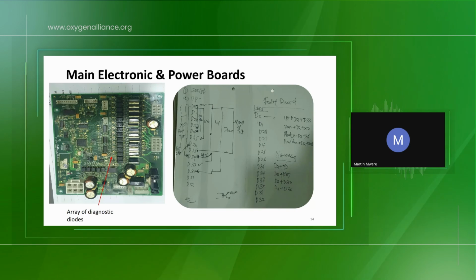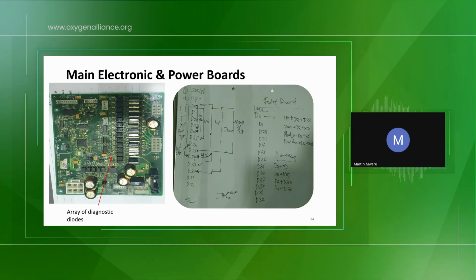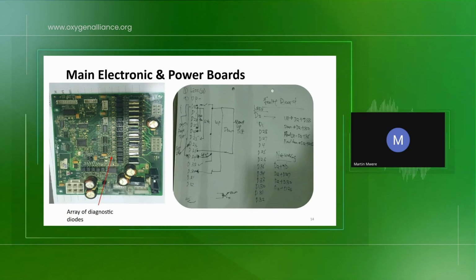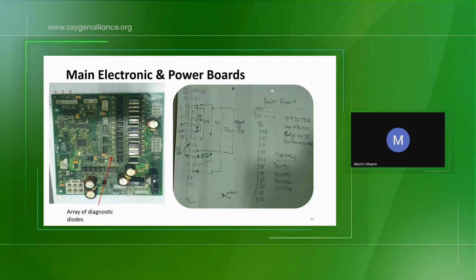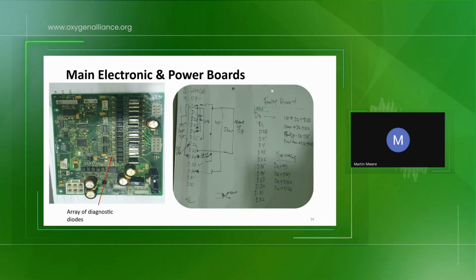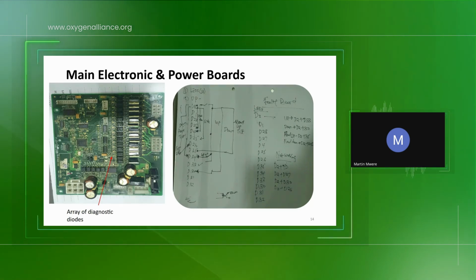Once you find that a MOSFET is not working, you detach it from the board and solder in a new MOSFET. At this time, you must follow the part number of that particular MOSFET. The optocouplers will also match the kind of MOSFET you are working with. These are the optocouplers. Not everything within the electronics will go bad. Like in this PCB board, the most probable electronic components to be faulty are these two.